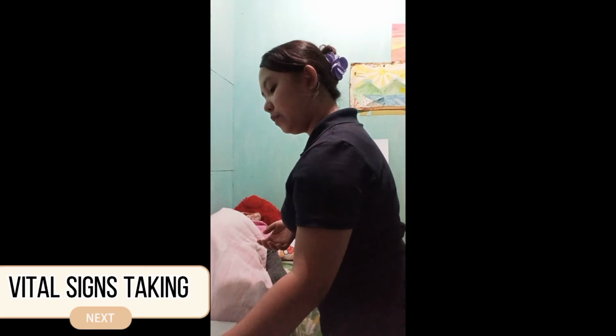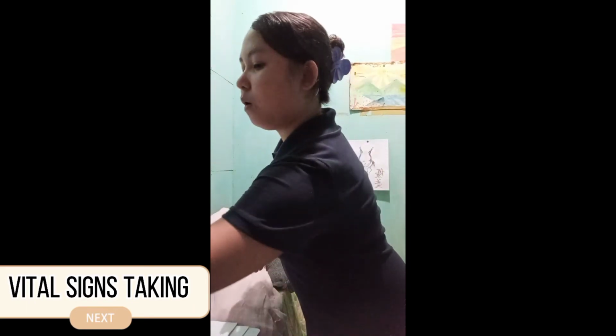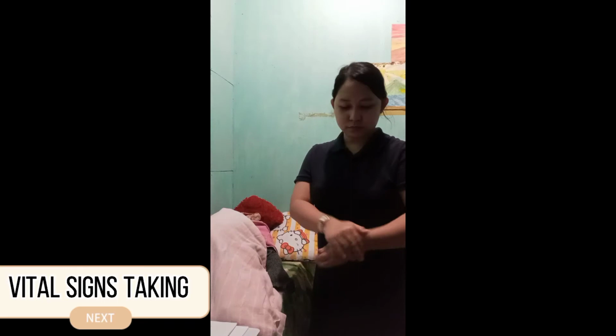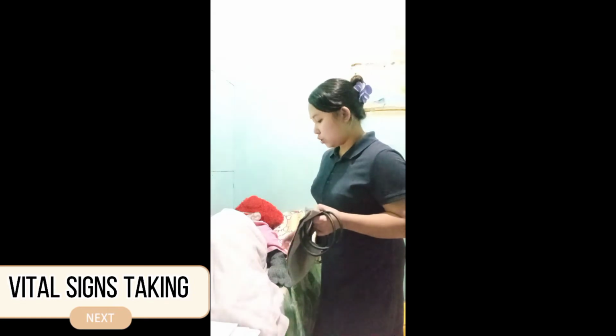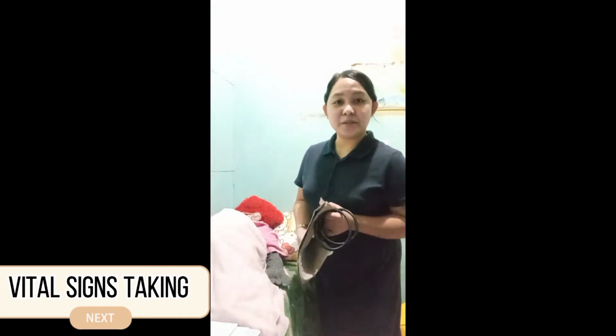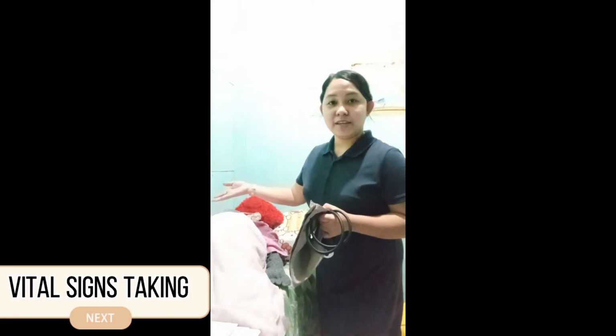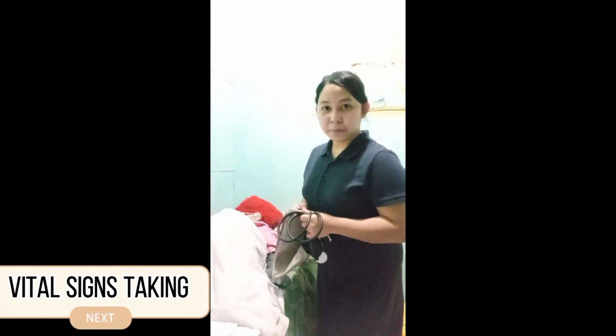I will assemble my equipment here. Is that okay for you? Then, wash your hands or sanitize your hands using an antiseptic solution. Now place your client in a comfortable position. I place my client in a supine lying position with the arm at the level of the heart and the palm facing up. Preferably in taking blood pressure, we use the left arm because it is near the heart, but in this demo, I will only use the right arm. Now place the cuff on the arm, and wrap the cuff around the arm of the patient.